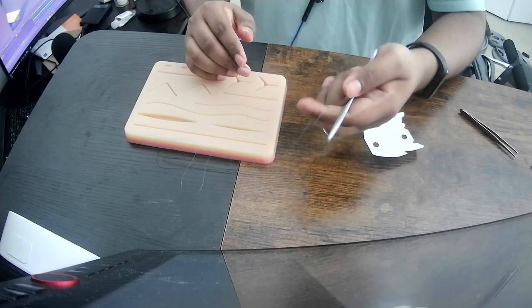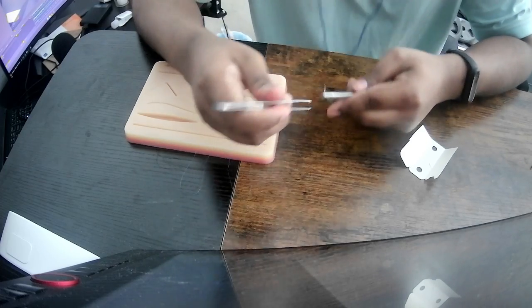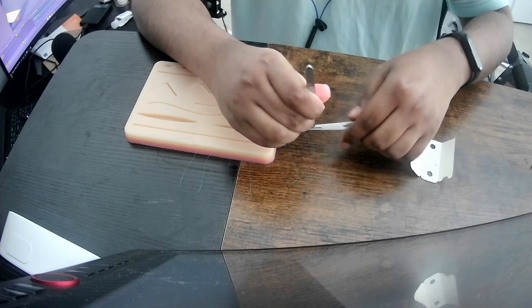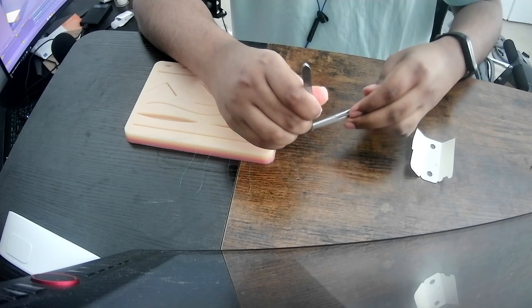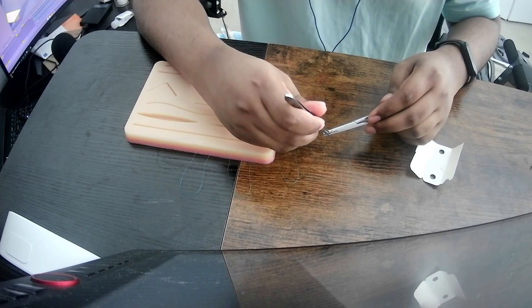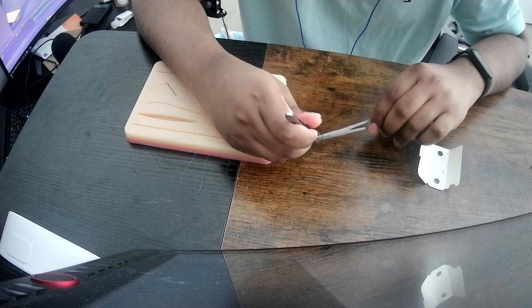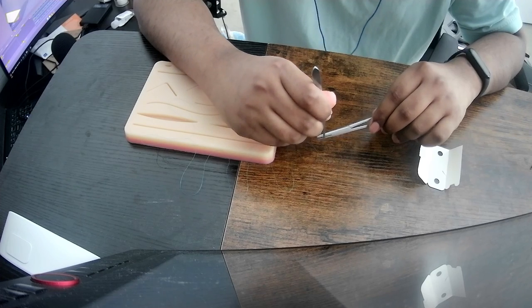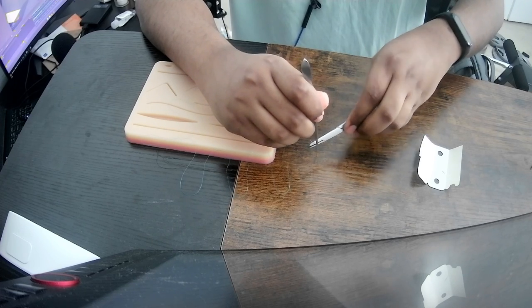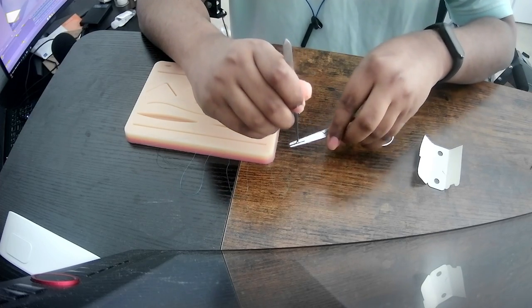Oh shit. I guess if this is left-handed, I don't wanna do it like this. I wanna flip it around. So let's try. I guess this is a good practice to use the forceps again and be composed. Gotta be careful. Okay, I think the best strategy is using the two-pronged side facing away from me. Okay, let's do this. Shit, it's stuck again. I'm not good with my left hand at opening this.